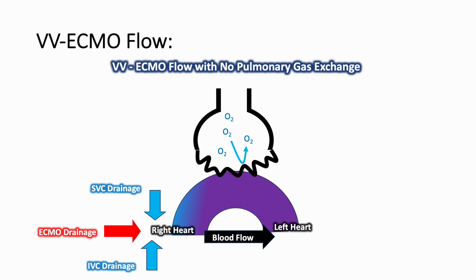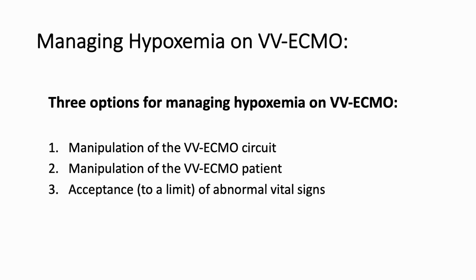Because the now arterial blood, again, remains unchanged and exists as that mixture, it's expected that the systemic SpO2 or SaO2 will be less than 100%. That's an expectation in VV-ECMO with severe lung pathology, and that's very important.